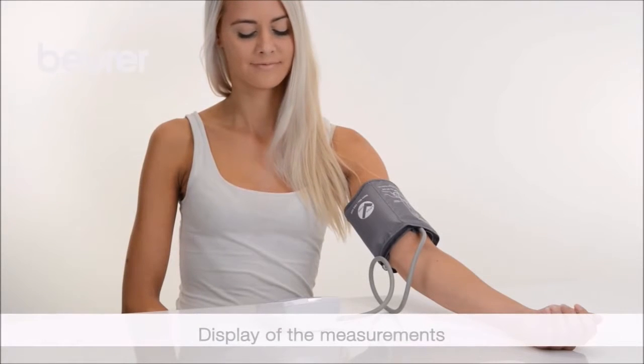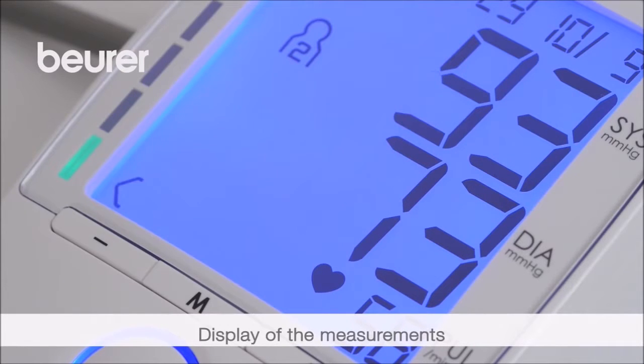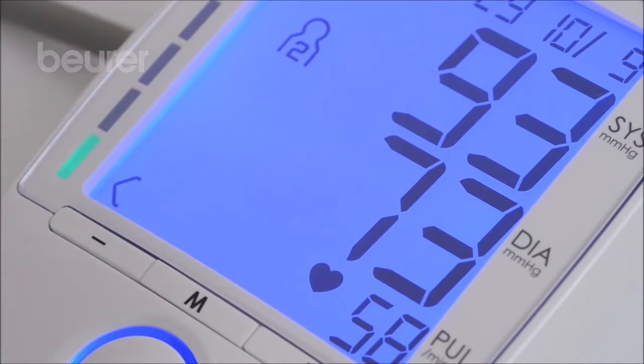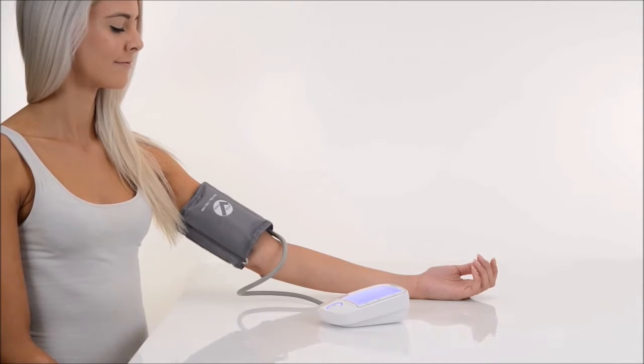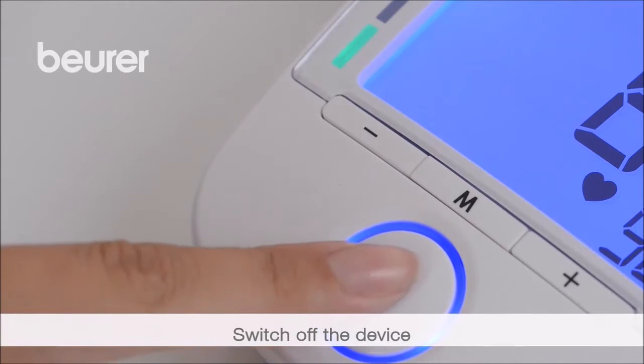Systolic pressure, diastolic pressure and pulse measurements are displayed. The measurements are stored automatically. To switch off the device, press start/stop.